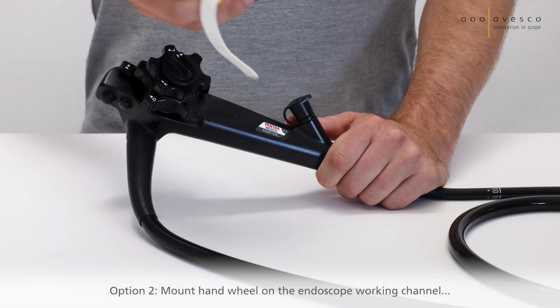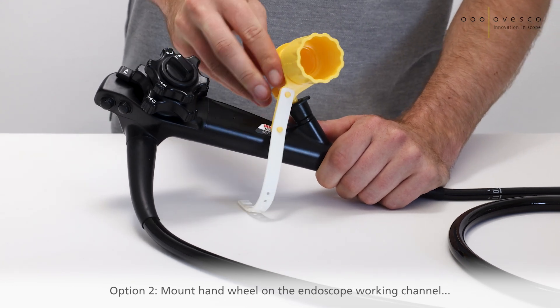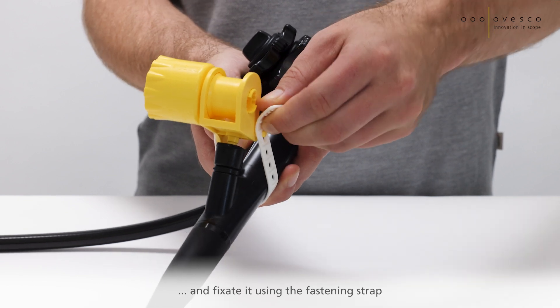Option 2: Mount the handwheel on the endoscope working channel and fixate it using the fastening strap.